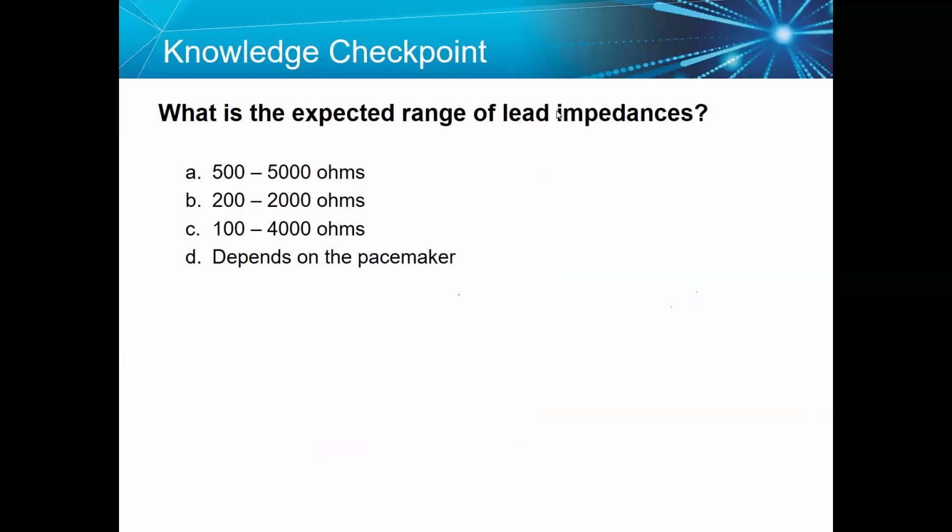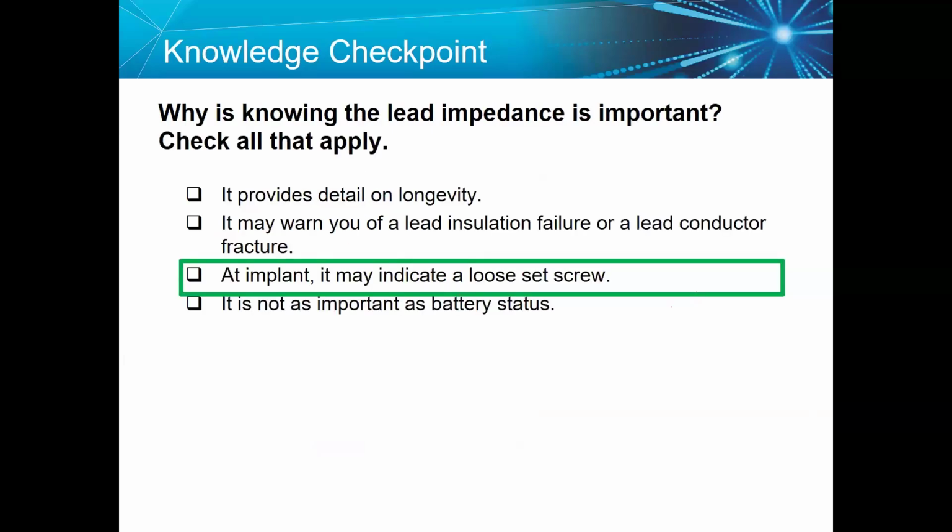They choose B. Okay. B, yes, it is a correct answer. Between 200 and 2,000 ohm.